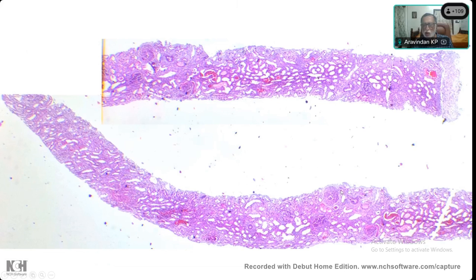And what do you think of the glomeruli? Are they enlarged? Yes, sir. The Bowman space is obliterated. They seem to be bigger, no? So enlarged glomeruli are there, yes. And tubular atrophy, there seems to be some dilated tubules. I wouldn't like to use that word because many of these things are reversible, but there definitely seems to be some tubular loss, at least temporary tubular loss is there. And here, RBC casts are there. See, look at this.